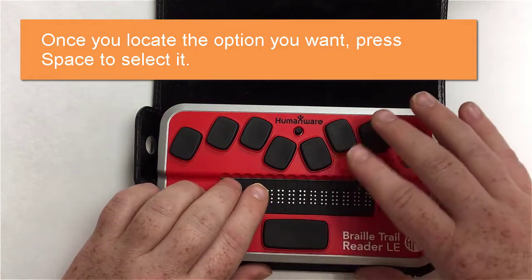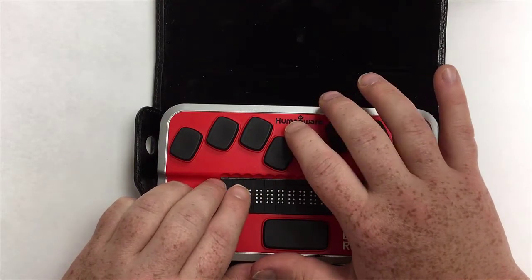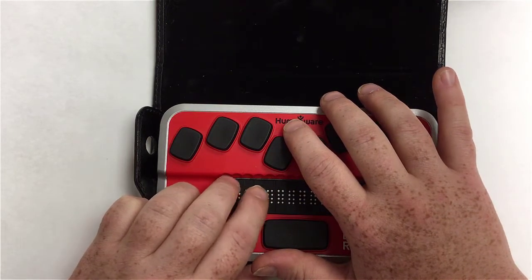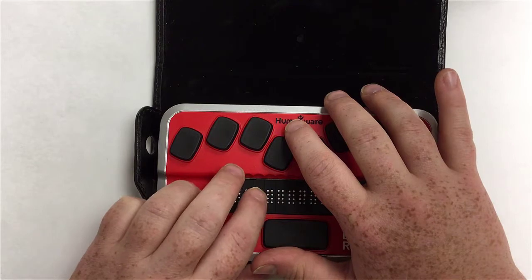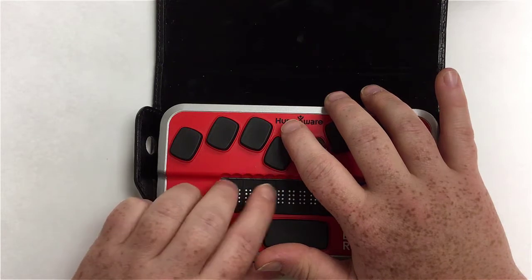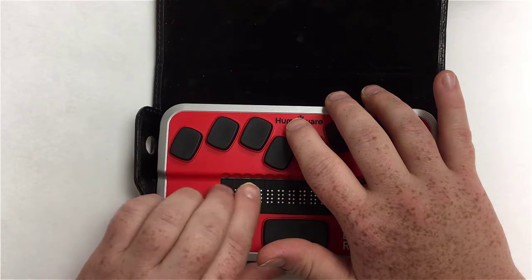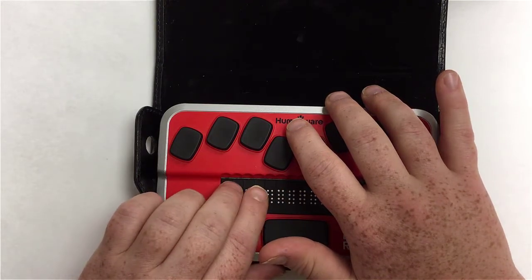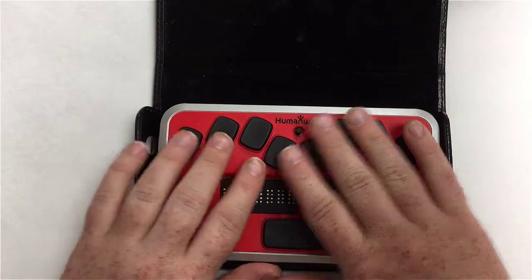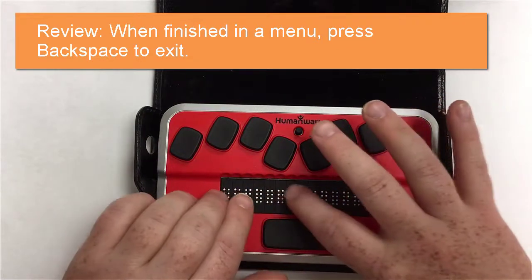Entering the auto power off menu, there's a full cell next to a number indicating the current setting — currently 10 minutes. To change it, use the outer thumb keys or joystick to cycle through options: 15 minutes, 20 minutes, and so on. I'll select 20 minutes by pressing the space bar — a full cell will appear next to that option. I then hit backspace to exit back to the auto power off menu item.